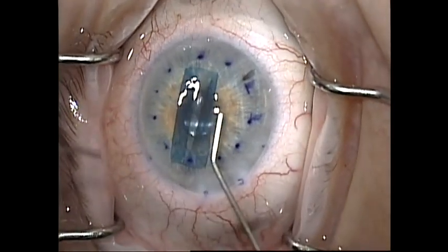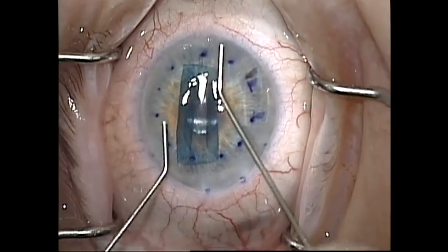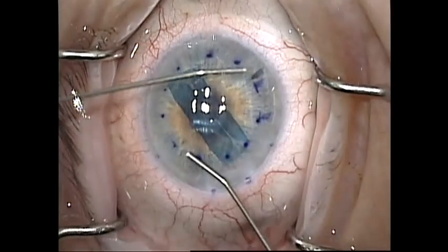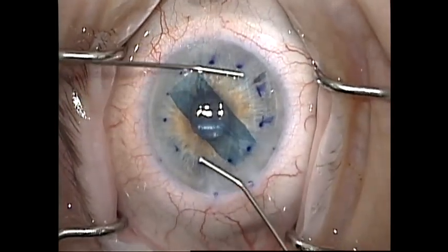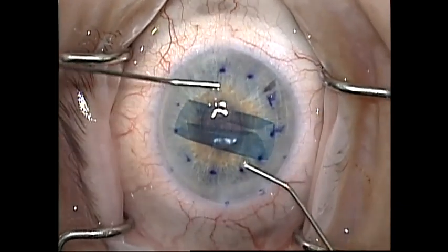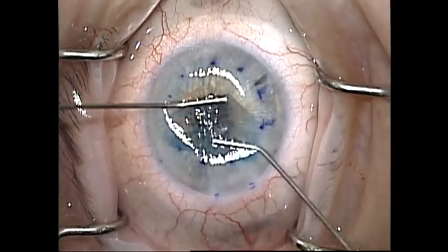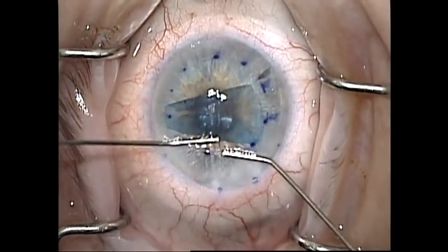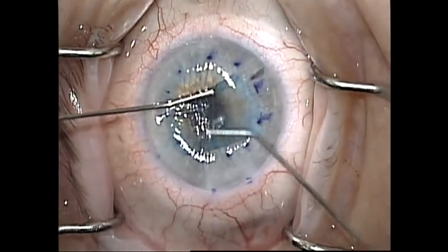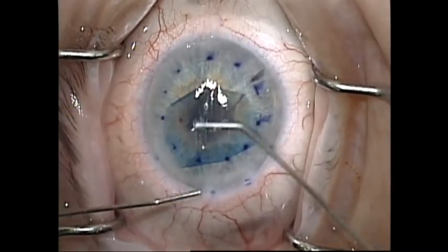I then block the incision with the cannula and remove the injector. I then set about unfolding the graft as I have detailed in other videos. In this video you can see that I'm using two cannulas to rotate the graft to position the S-stamp superiorly. Occasionally there is more edema around the area of the S-stamp and I like to have it in an area of maximal graft support. I also like to rotate the graft perpendicular to any corneal folds as I find it is easier to unfold.